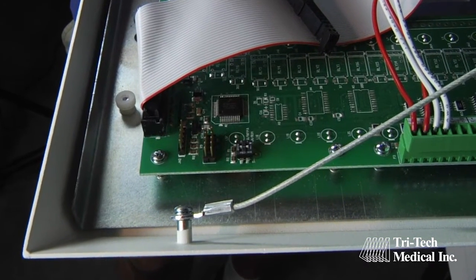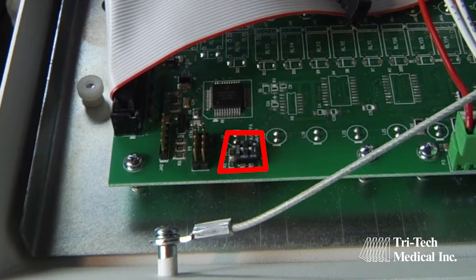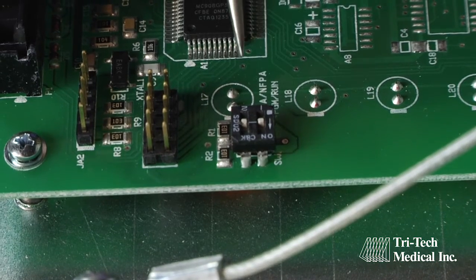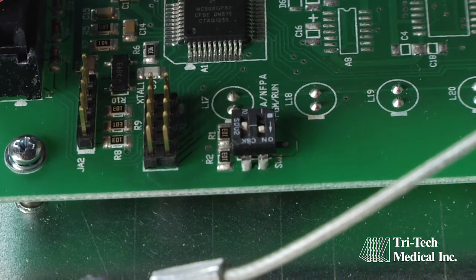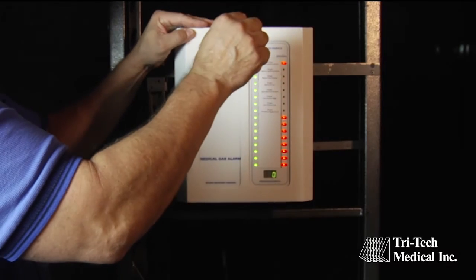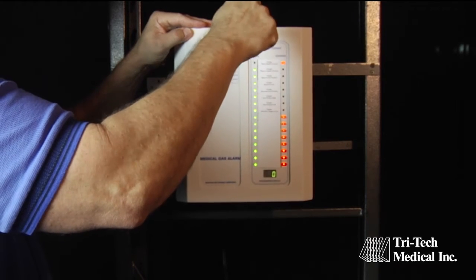Locate the run/program DIP switch on the back of the first master circuit board to be programmed. Using a flat blade screwdriver, gently push the DIP switch labeled run/program from the run position to the program position on the first master board only, and close the alarm front. Only one circuit board may be placed in the program mode at a time.